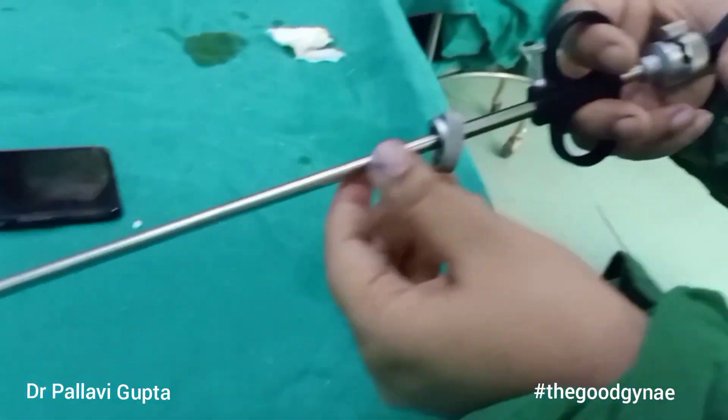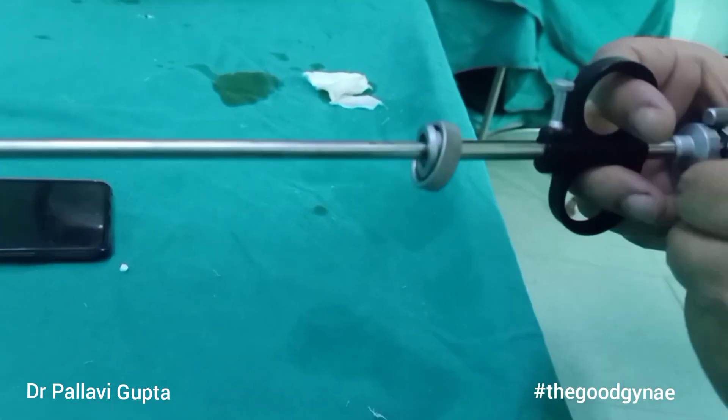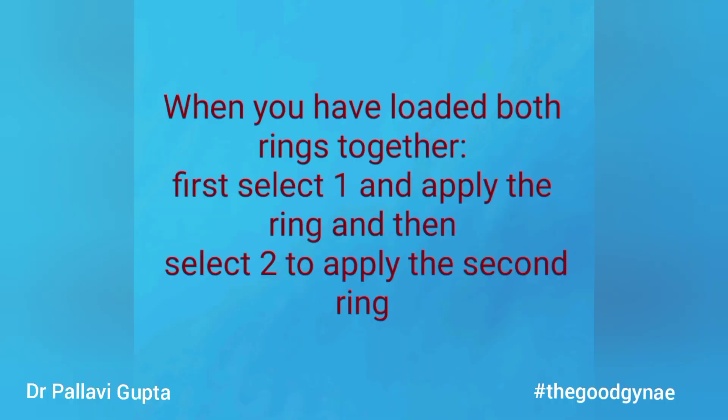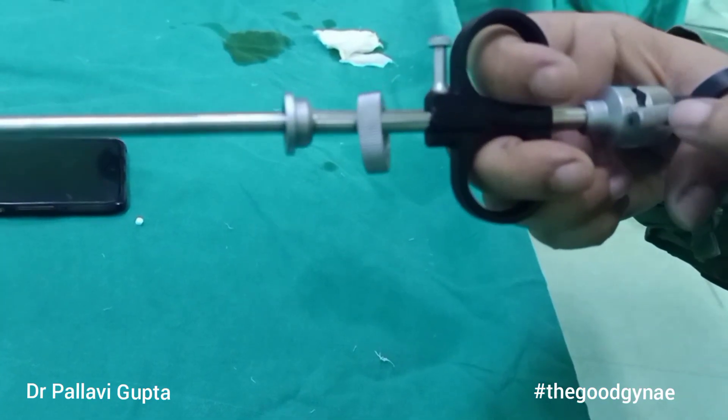One or both rings can be loaded at a time; here we are using one ring. Note how the laprocator is held with the help of fingers and thumb, like a syringe. The ring delivery collar is set at either one or two depending upon the number of rings. When loading both rings, we first select one, apply the ring, move it to two, and apply the second ring. When loading only one ring, we select two.